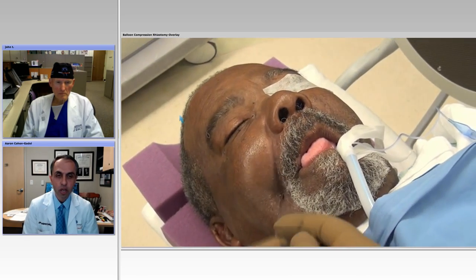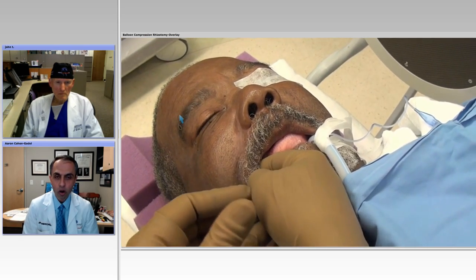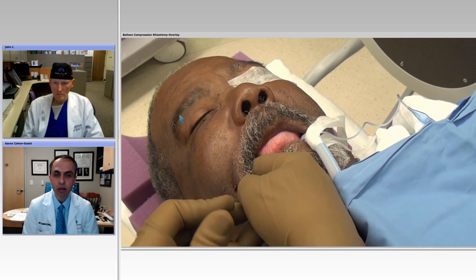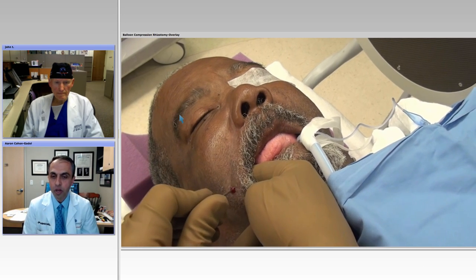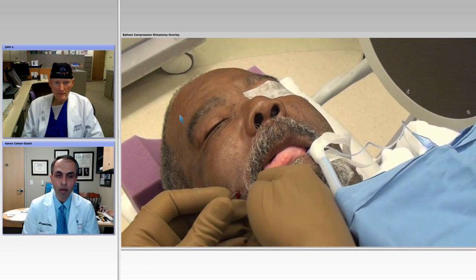We stab the incision to create a nice entry for the needle of the balloon, which is larger, and then we obviously make sure the needle does not perforate the mucosa medially. And then we go ahead, and as you can see here, I just hit the angle of the mandible to make sure I'm on the right trajectory, and then I angle the needle more medially, and that gives me another view of how things are in relationship to the foramen.